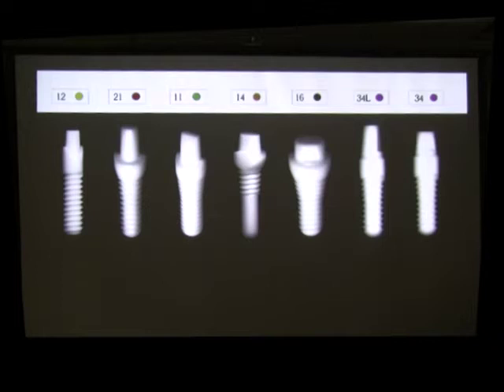We work together in grand years. I've been three years now in California, and every time I get a chance to go to Barcelona, I enjoy doing surgeries with them. We started developing the system about eight years ago, and the first implants that we used were prototypes, very similar to conventional titanium implants. And when we say conventional, we mean implants with a flat platform, implants that did not mimic the tooth structure.